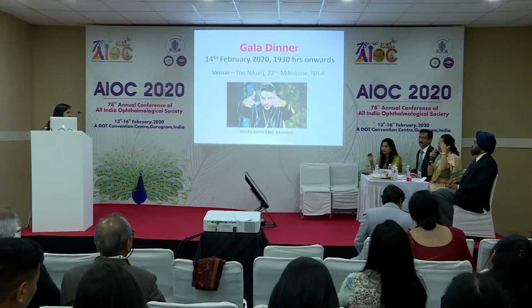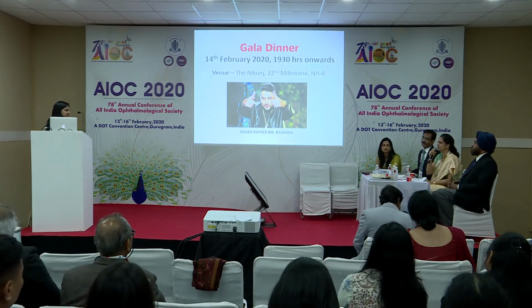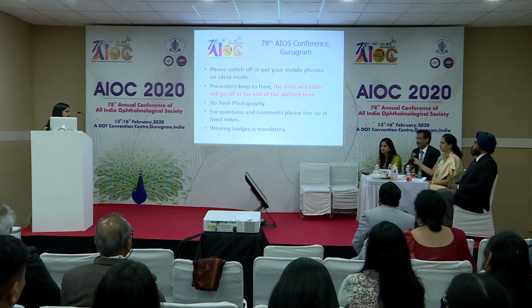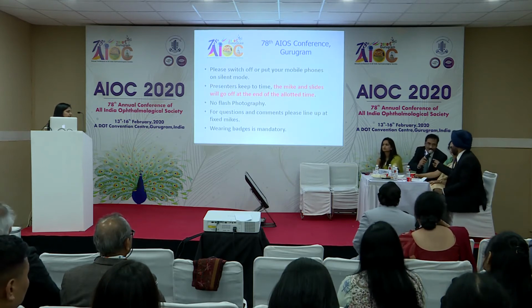Canthus, but higher, just a little higher, because with gravity it is going to come down. So we should just go a little higher than what we would otherwise want. Yeah, slightly, 1 or 2 millimeters higher than the medial canthus. I'll ask Dr. Mandeep also to comment on this particular procedure.